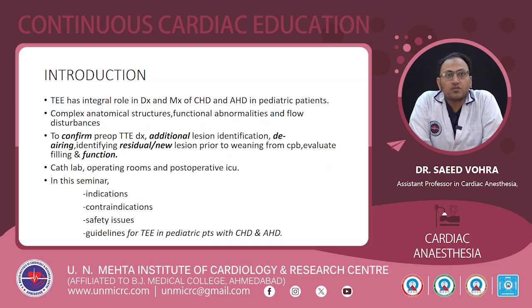TE is very useful in cath lab, operating rooms, and post-operative ICU in pediatric patients. In this seminar, we are going to see indications, contraindications, safety issues, and guidelines for transesophageal echocardiography in pediatric patients with congenital heart disease and acquired heart disease.